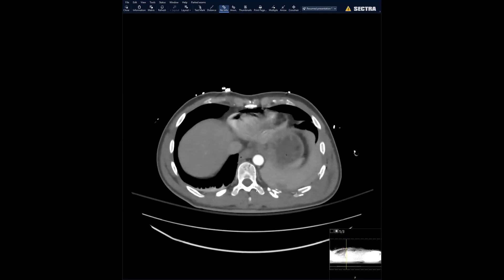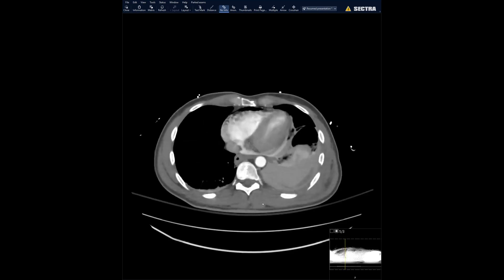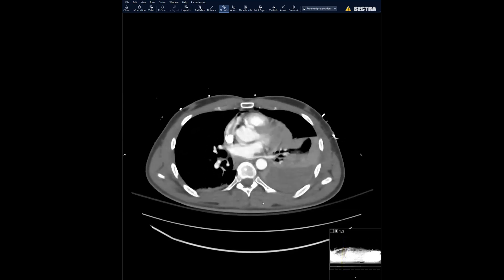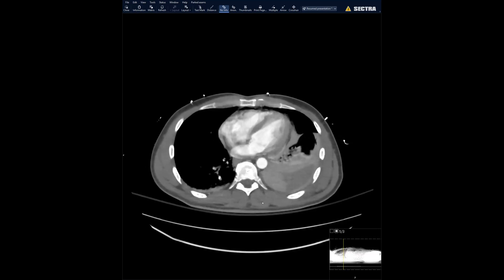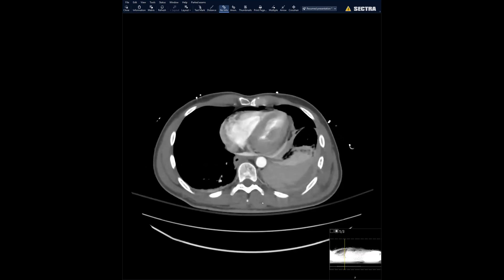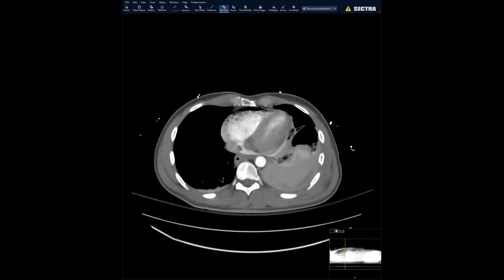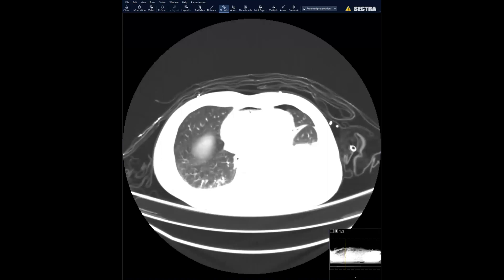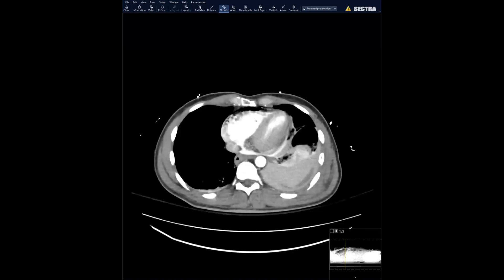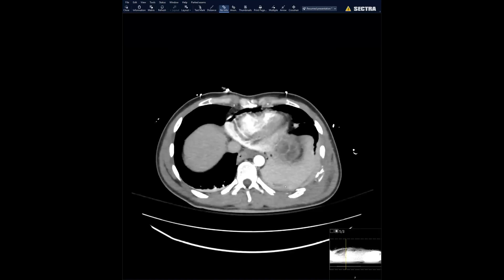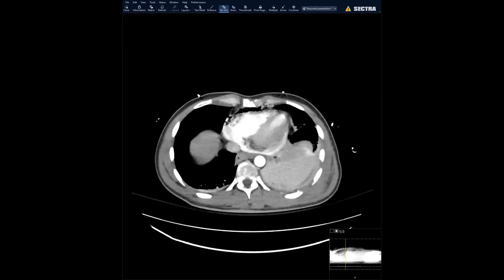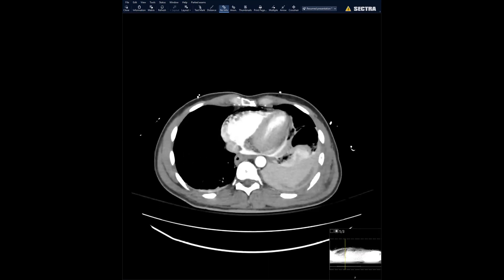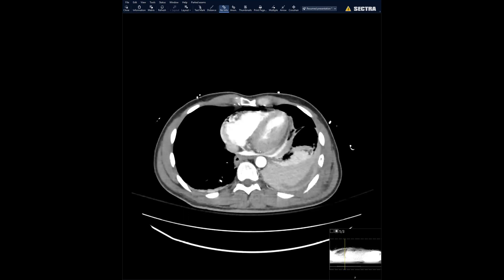The pertinent findings are only on these images. But there are also — air in the heart? Yes, there is pneumopericardium. And then going down a little bit more, is there blood in the pericardium? Right. There's contrast in the pericardium.